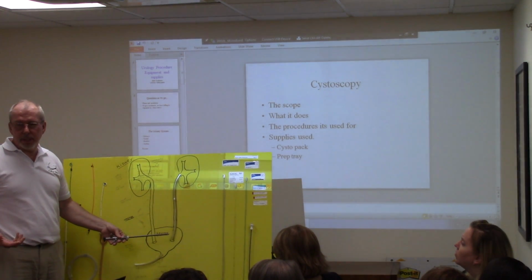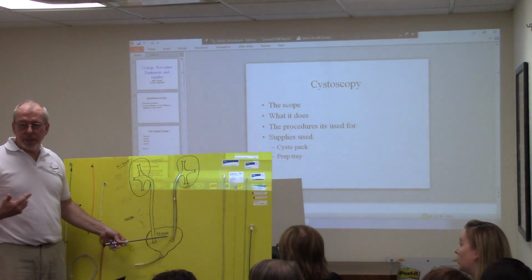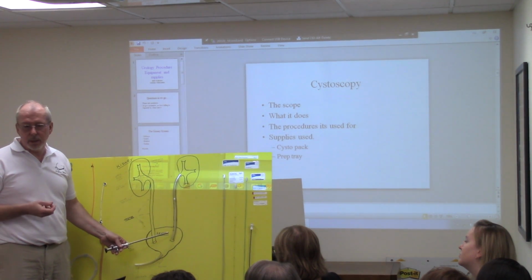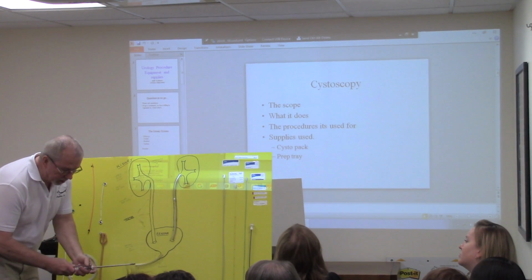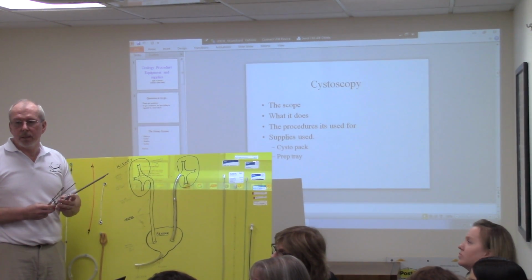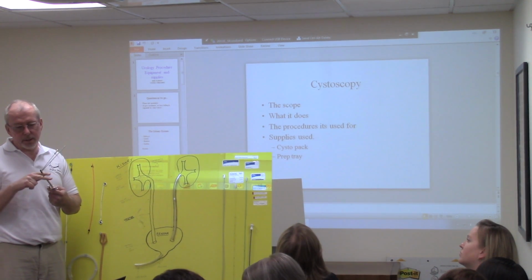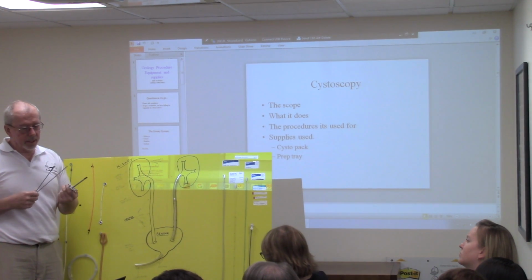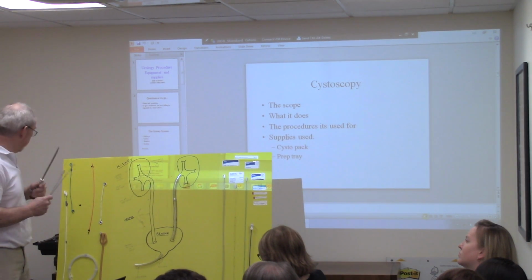And you usually do that if there's bleeding. Causes could be, if it's not a stone, a little bladder tumor or just irritation, infection. So that's the basic. Bob, is that the basic one that you do, like when you go to a doctor's office and they say you have blood in your urine? Yeah, they'll just do a quick, basic look. And this scope here is a little bit bigger than what they usually use in the doctor's office. That's because we can use anesthetic in our setting.